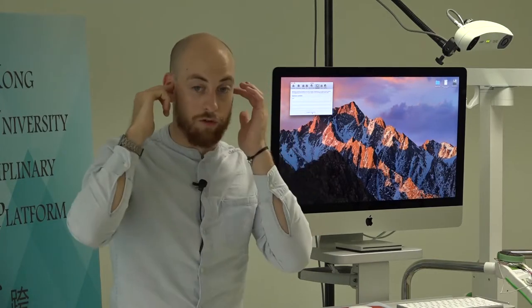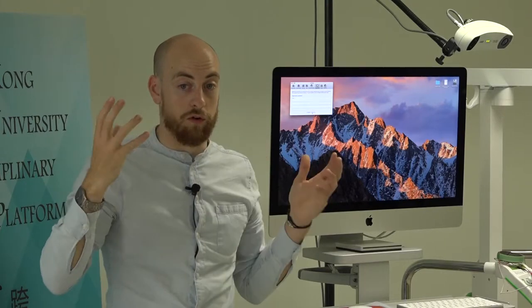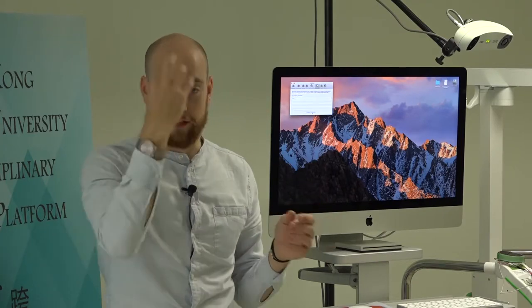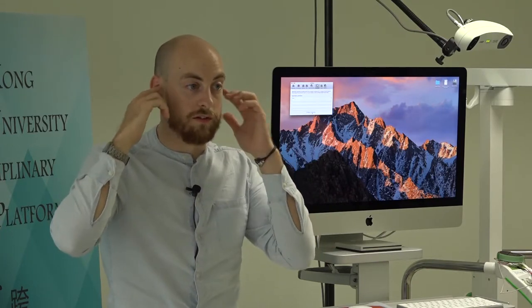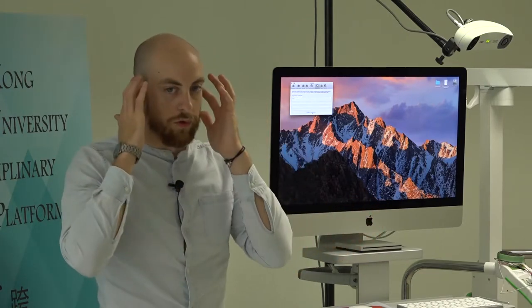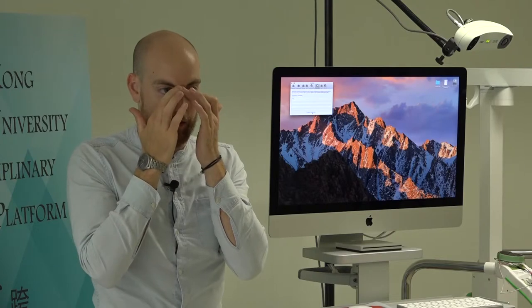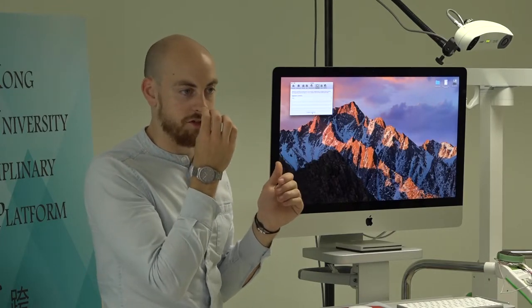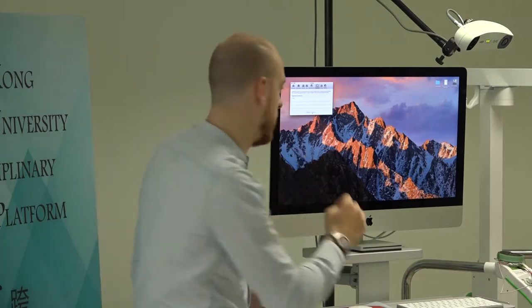So again, they're roughly the same place in all humans, and the brain sits in the same place relative to those points in an individual. And what we can do as well, because those three are on the same plane across there, it's good to put the tip of the nose in as well. It just gives an extra dimension because it gives you a bit of depth there.